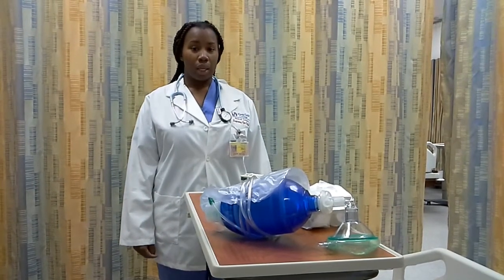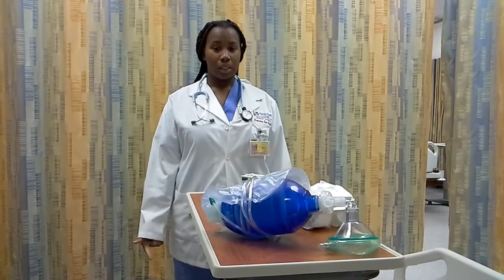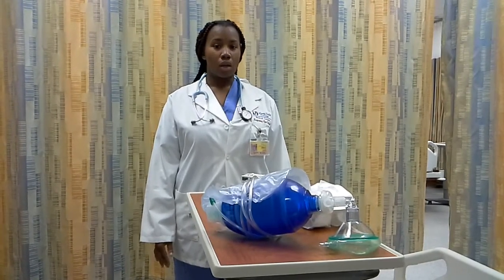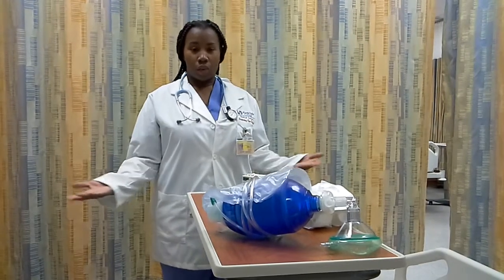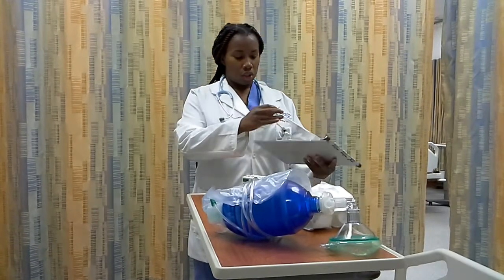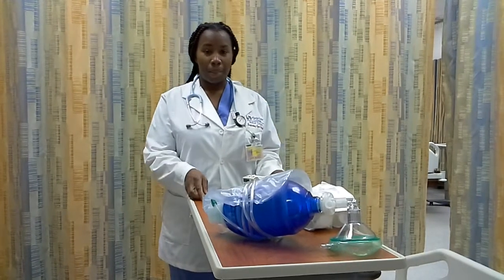The hazards for tracheostomy care include tachycardia, hypoxia, hypoventilation, bleeding, atelectasis, and any signs of respiratory distress. Now to begin, before you begin tracheostomy care, you will go ahead and verify your physician's order. My physician's order says tracheostomy care, so I'm going to go ahead and do that on my patient.